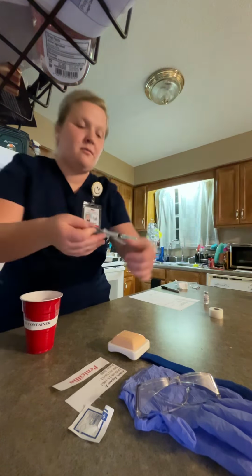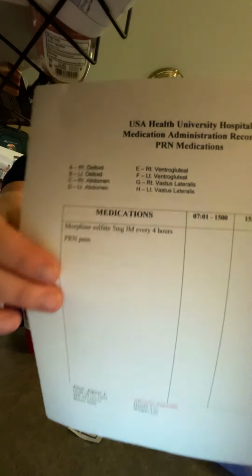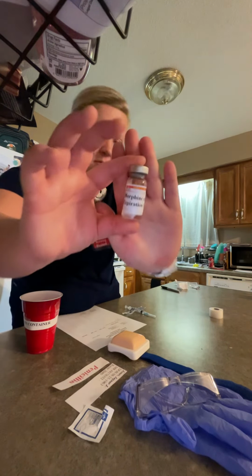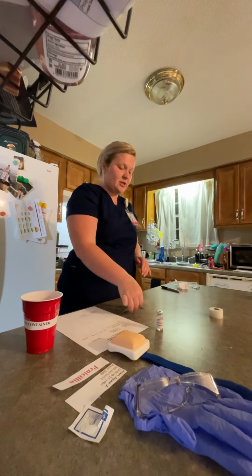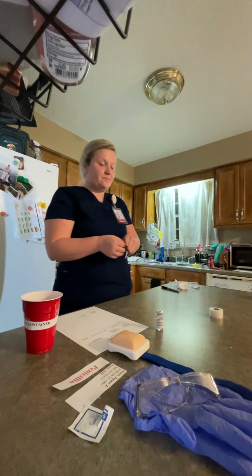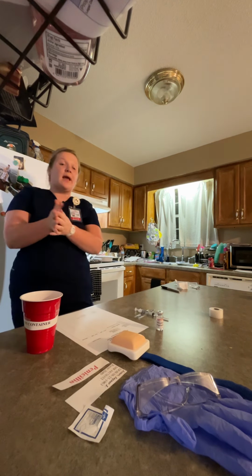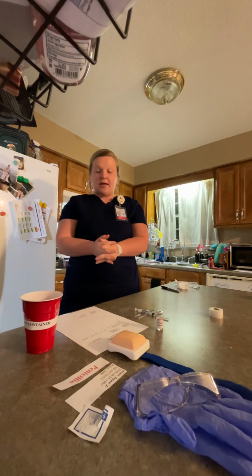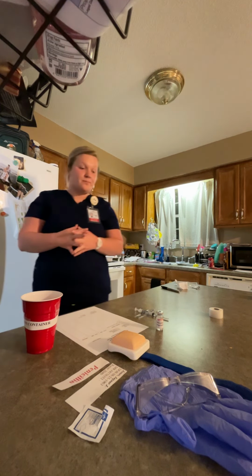Now I will be taking my MAR, my vial, and my syringe and needle with my label to my patient's room. I'm going to perform hand hygiene. I'm going to introduce myself to the patient. Hello, Mr. Jones. My name is Victoria, and I'm here to give you your morphine sulfate, your pain medication.